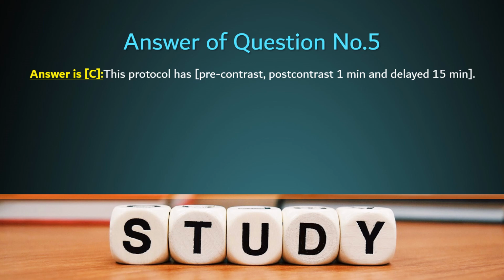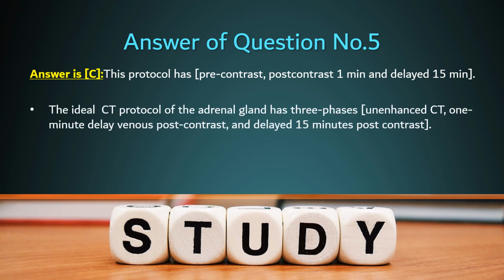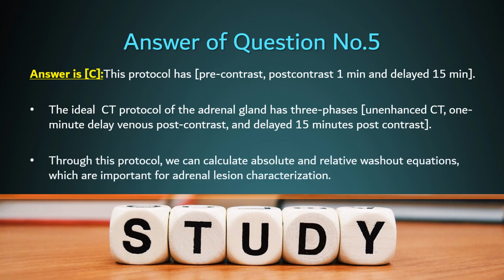And this protocol is designed for characterization of adrenal lesions, especially differentiating adenomatous from non-adenomatous lesions. Through this protocol, we can calculate 2 famous equations, absolute and relative washout equations, which can characterize the adenomatous lesions from non-adenomatous lesions, as we will discuss this in the coming cases.